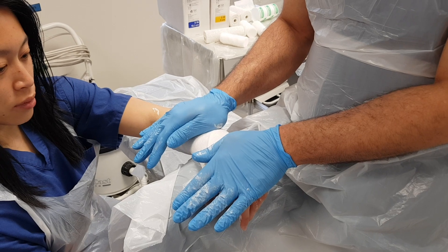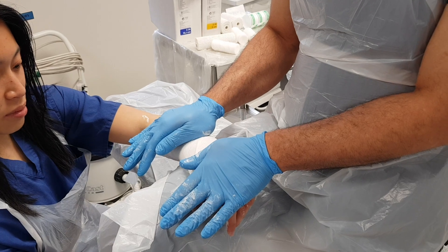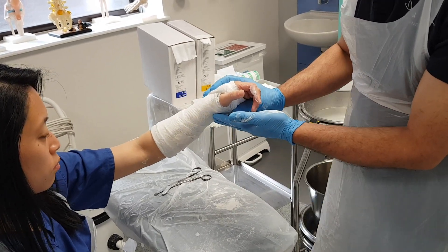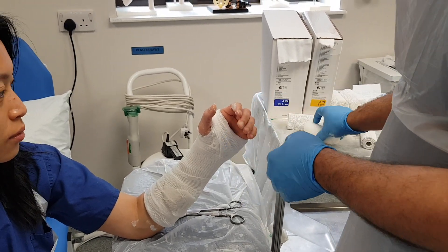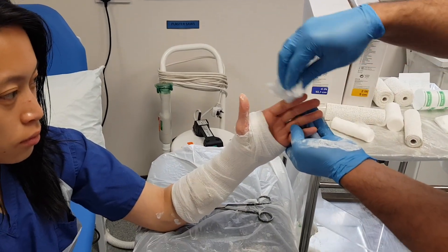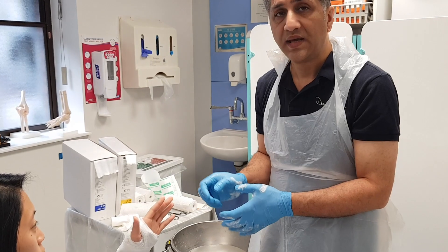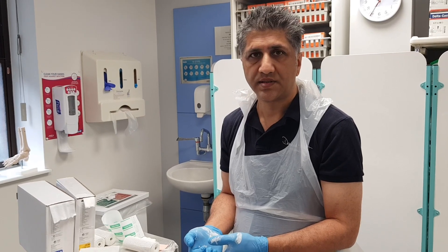The plaster itself can take several hours to set. It's not a good idea to try to accelerate the drying by using a hairdryer or anything else — just let it set naturally, but obviously avoid it getting wet. Now we have a slightly curved plaster where you can see where the pressure has been applied. After any procedure, check that sensation is still intact, there are no pins and needles, and check the capillary refill. You can use a bit of plaster wool to clean any excess plaster from the patient's skin. After any intervention, you should get a check X-ray to make sure that the position is acceptable post-application of the backslab.